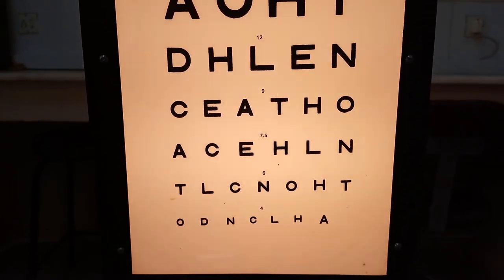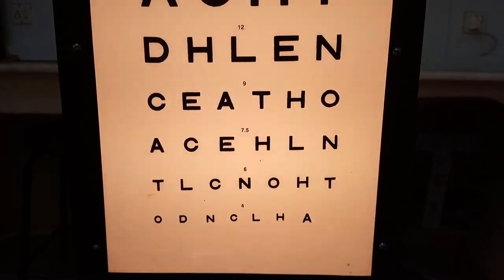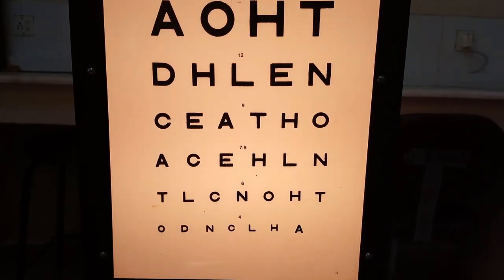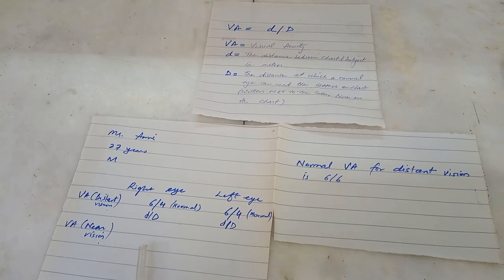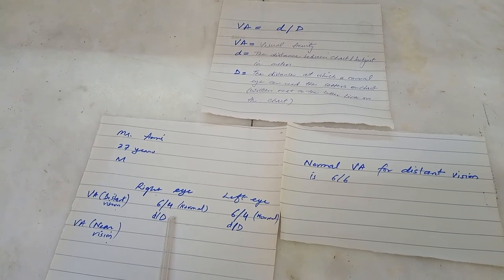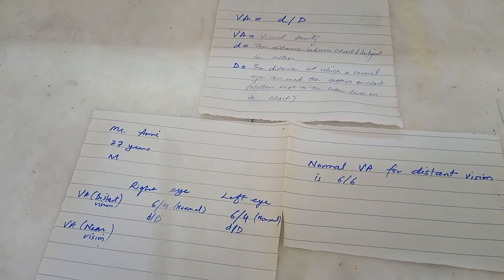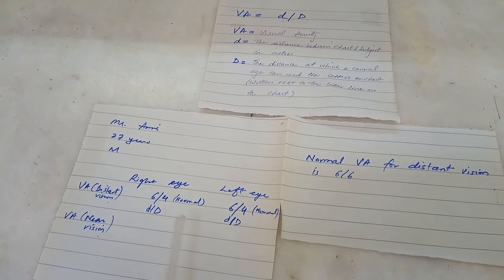So we'll say his visual acuity for left eye is also 6/4. 6/4 means 6 is for the distance between the person and the chart, and 4 is the line which he was able to read at which distance it is normally seen. So you can see that this is the visual acuity of Mr. Amir. Right eye 6/4 and left eye is 6/4 as well, and this is how we have written it. It is still normal, actually better than normal, but we will say it's still normal.